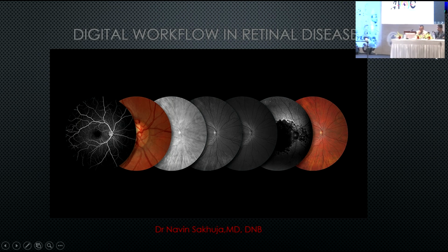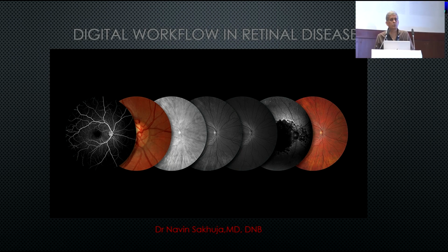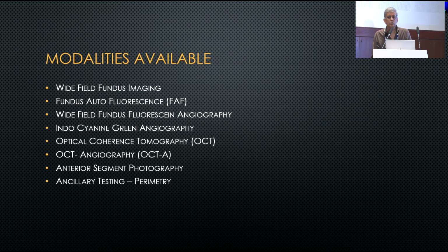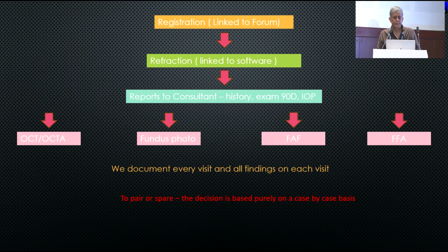So I'm going to do this 7-minute race to try and finish whatever I can to tell you about this digital workflow in retinal disease. Now, we all know that there are multiple tools available to all of us, and every one of us is already using them, where we use multiple methods of different technology to either diagnose, prognosticate, manage, or monitor disease. I'm not going to go through the modalities, all of us already know them, but I'm going to talk to you about the way we run it.